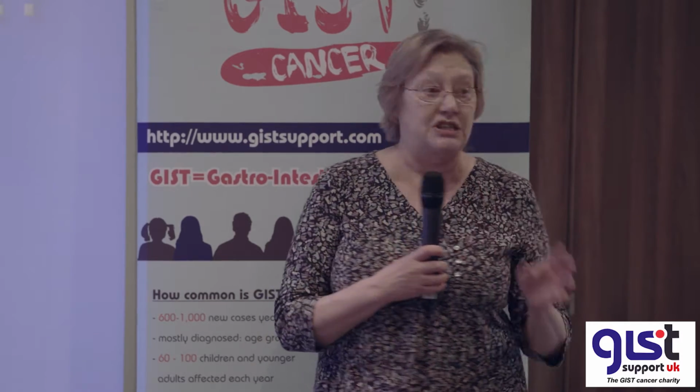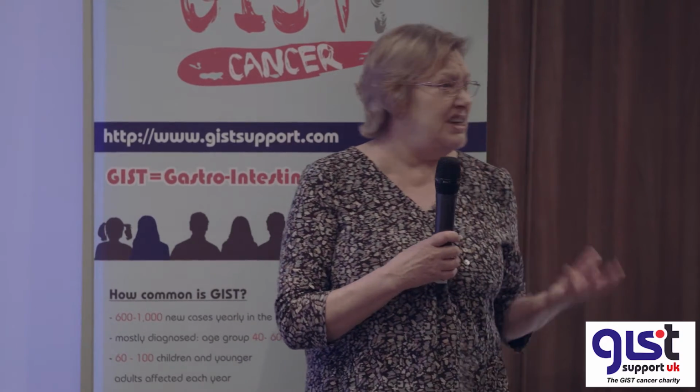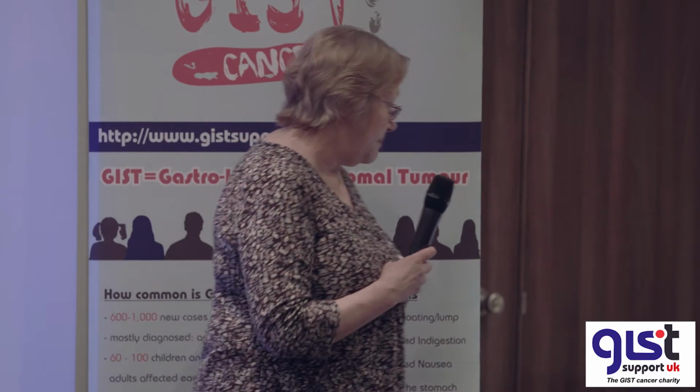So if we started with a CT, we'll tend to go on with CTs. If we started with MRs, which we don't very often with GIST, because CT is just about as good as MR for the abdomen. If we did, we'd continue with it. And sometimes we'll do that for liver. Not ultrasound. Ultrasound's not quite so reproducible. So my job's mainly comparing CT scans.